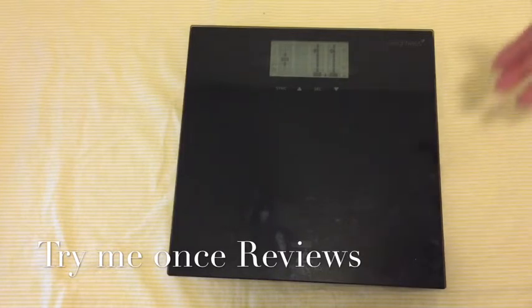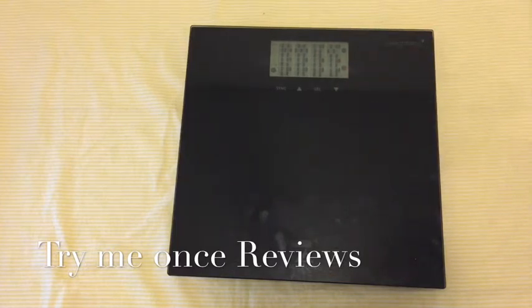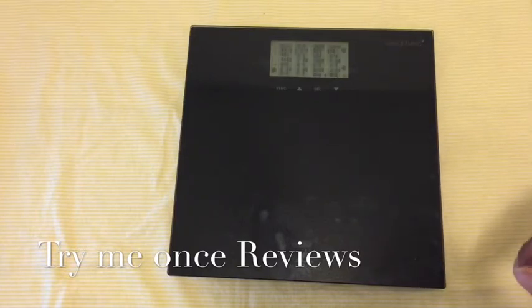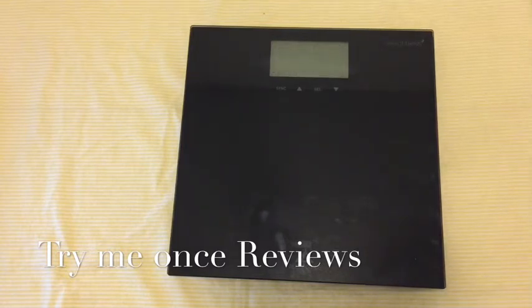You can track your weight throughout a period of time, and the scale will also measure your weight and tell you the difference. It's an excellent device. I've also noticed this one is pretty accurate — if you step on the same scale three, four, five times, this one had the closest readings. It hardly varies by 0.1 of a pound, compared to my other weighing scales. It's a highly accurate and very affordable device, and if you're looking for a bathroom weighing scale, I think you should go for this. This was B for Try Me Once Reviews — thank you.